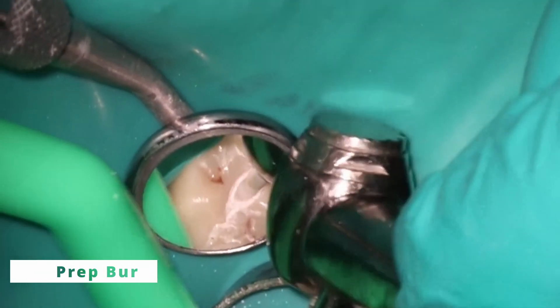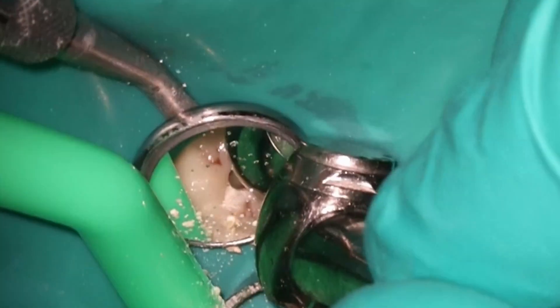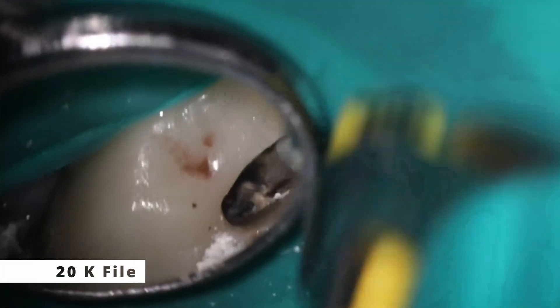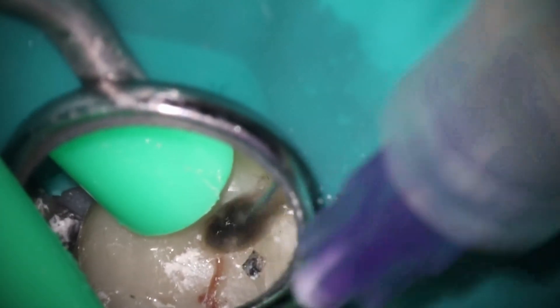Coming back a month later — actually a little bit longer than a month; the calcium hydroxide had broken down. This is a great patient, but he lives about four hours away so getting here is sometimes tough. When I remove the calcium hydroxide, I used the larger prep burr this time because that's about the size of it — no need to be more conservative, just keep it in there; it's a lot faster. Going back down with the 20 K file. He had gotten a little bit of food caught in there because it had been about two months. The MB2 actually went all the way down — it was patent this time. That's one of the benefits of using calcium hydroxide: it's able to soften and remove any calcification.